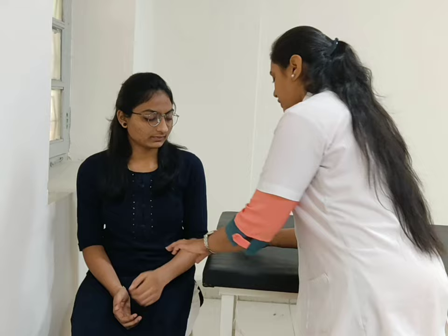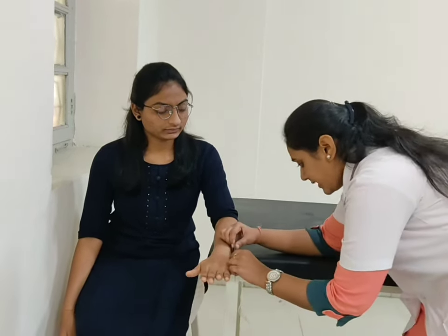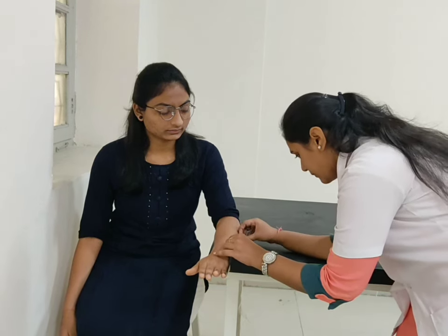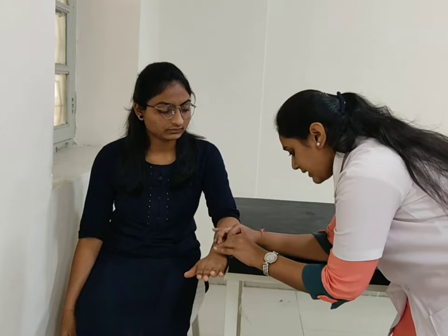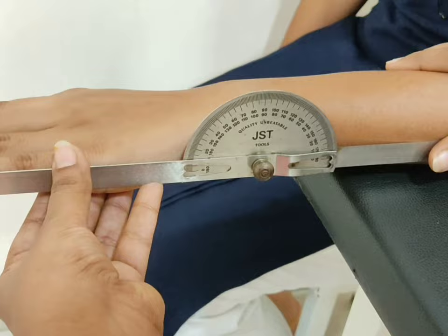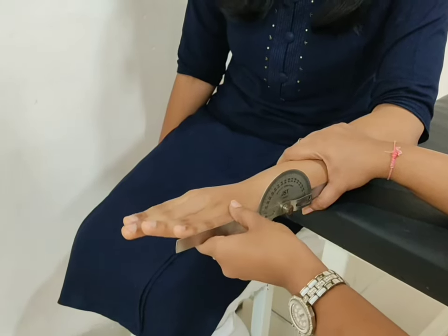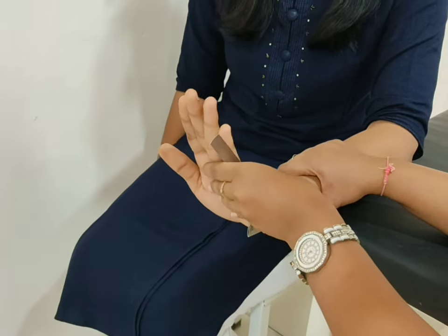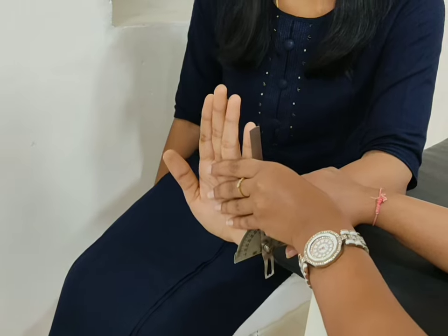For wrist extension, patient position sitting on a chair. Forearm resting. Fulcrum at the ulnar side. Stable arm parallel to the medial aspect of the forearm and movable arm parallel to the little finger. Now ask the patient to move your hand towards the ceiling. Normal wrist extension is 70 degrees.